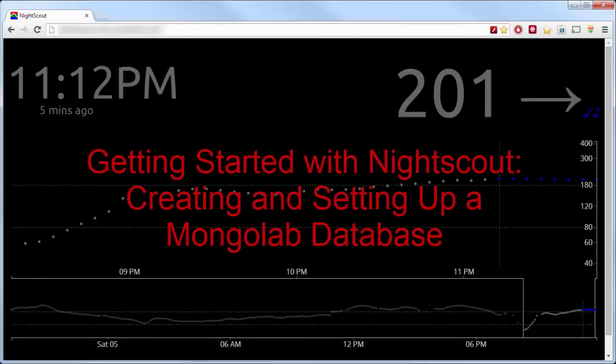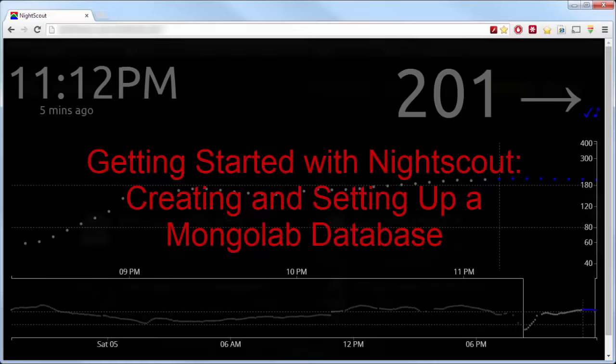This video is not meant to replace the Quick Start documents. It's meant to help clarify them.